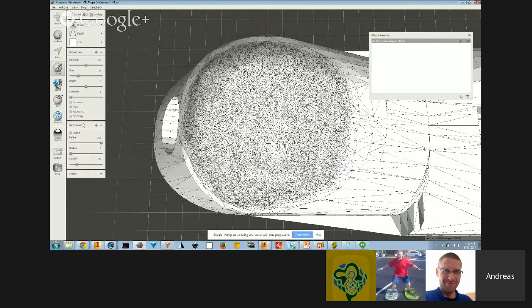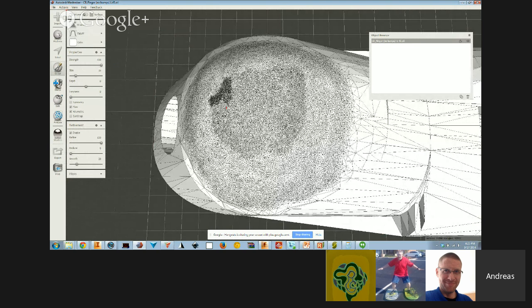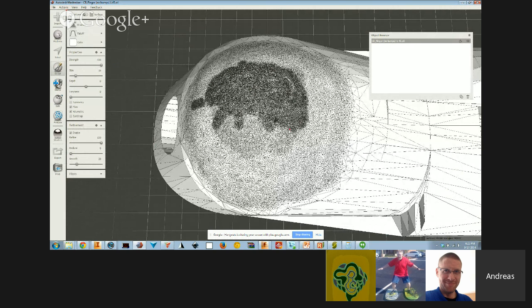I have a little smoothing going on, which is fine, so I'll just leave that on. But if I increase the strength, I get more density there. Also, if I reduce the size of my brush, it'll bump up the amount of triangles going in there. So that's just something. It's a neat brush where you can isolate where you need to get some more triangles.